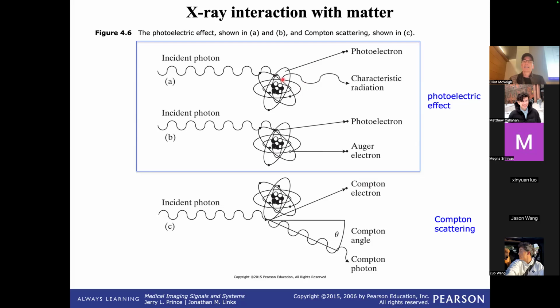Ideally, this characteristic radiation is at an angle that your detector doesn't see, right? And this photoelectron is just going to go on, interact with the patient some more and deposit energy, right? And so what has happened effectively is our photon came through and it just disappears in terms of our detector, right? And that's ideal. We want, along a line from our source to my detector element, photons to either be absorbed completely or get through, right? And then that gives me contrast in my picture.